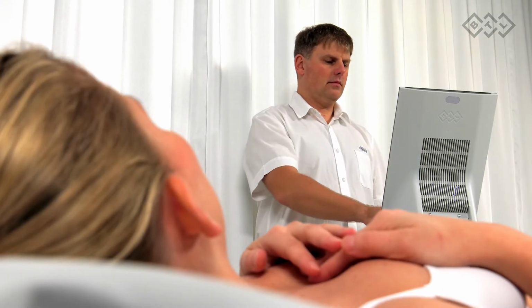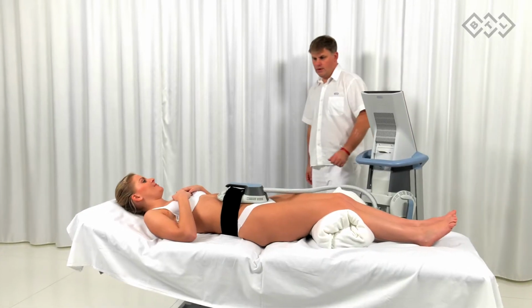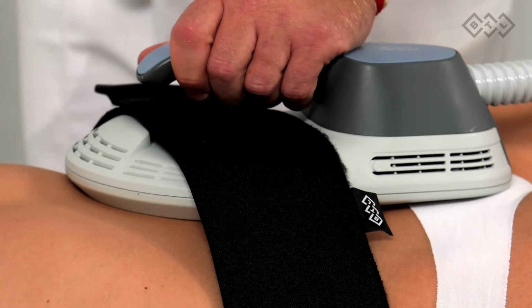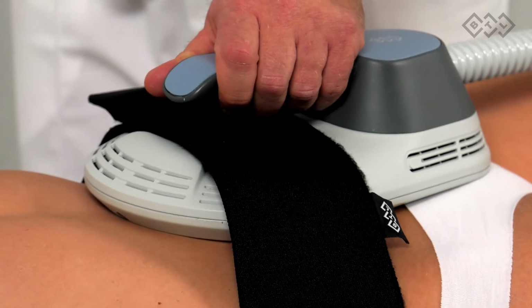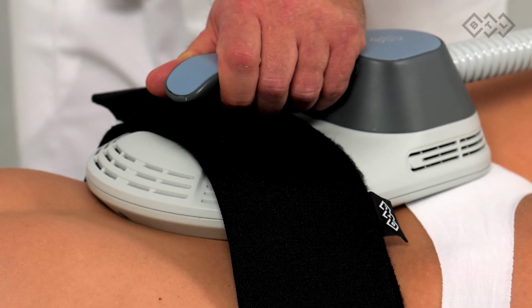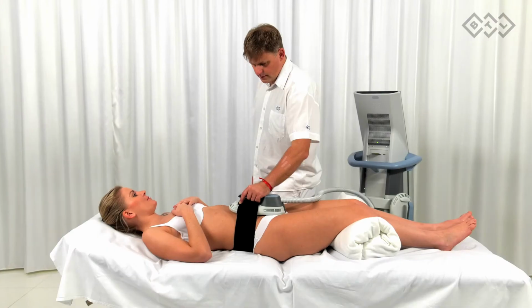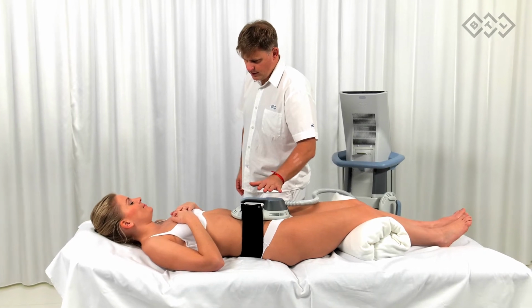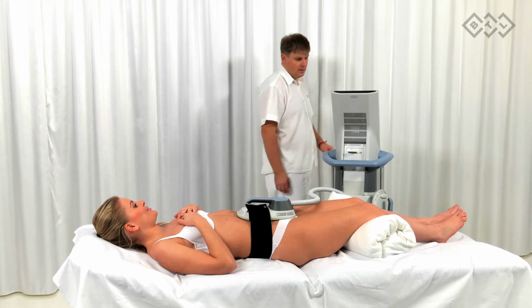Start the therapy. Increase the power intensity until reaching visible contractions. Correct the applicator's position to find the best muscle response. The patient should feel contractions homogeneously across the treated area. To ensure therapy efficacy, increase the intensity up to the patient's tolerance level. For an effective treatment, keep the treatment intensity at the level which causes the strongest possible muscle contractions.